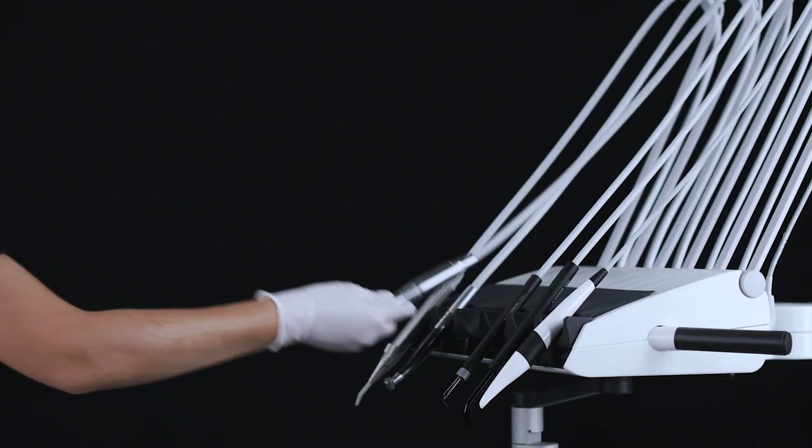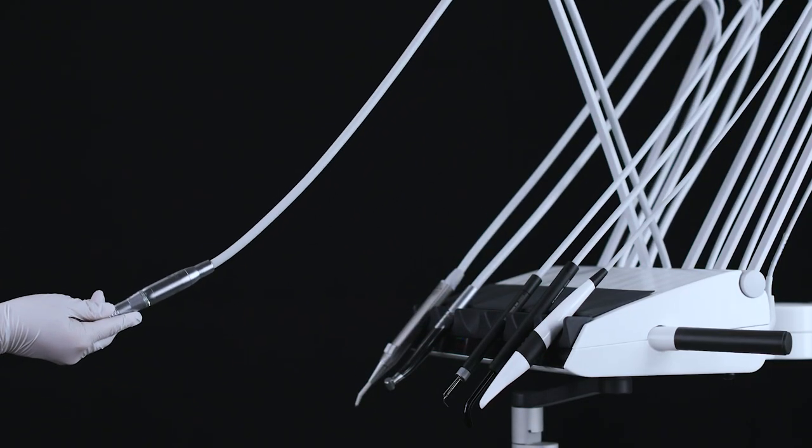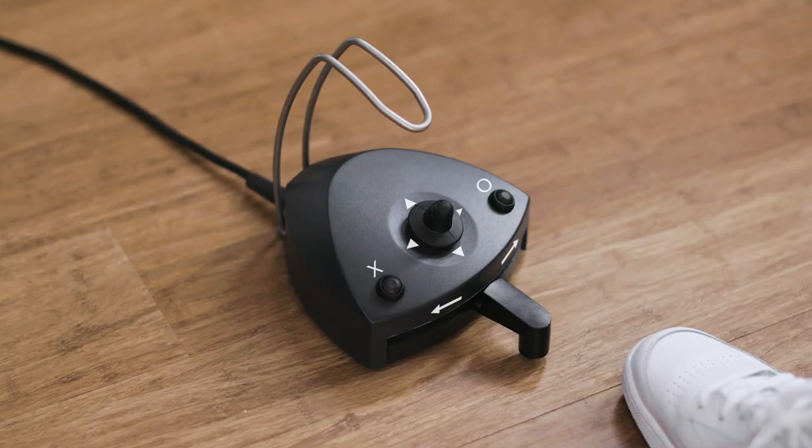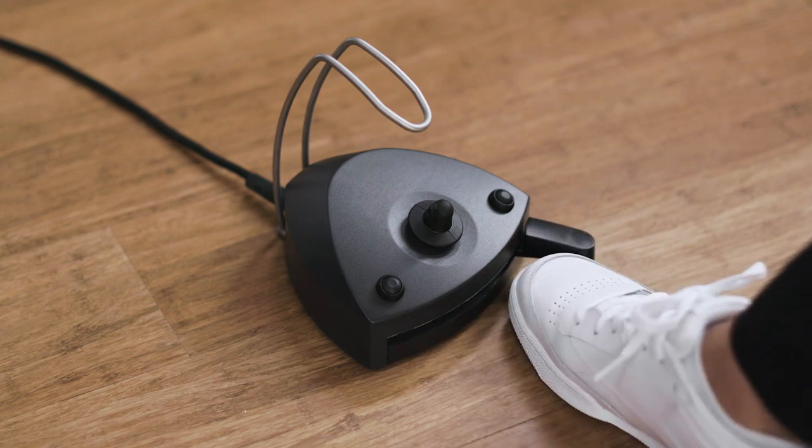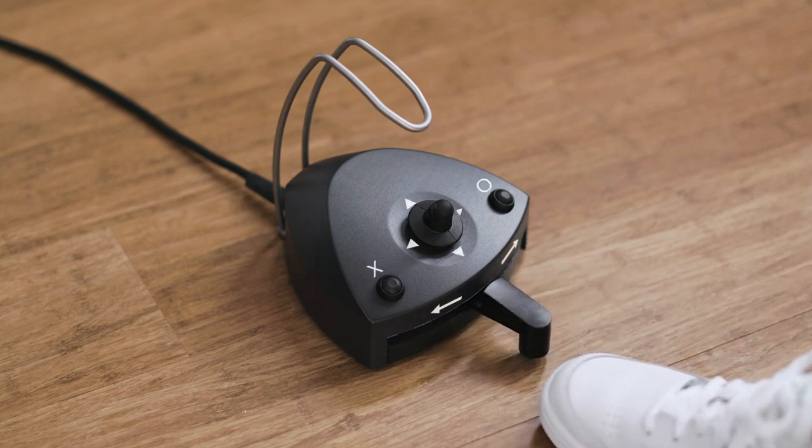Lift the micromotor forward and control it with the foot control. Activate the motor clockwise in the range of 100 rpm to the selected maximum speed. Select the maximum speed by moving the pedal right, or set it to rotate counterclockwise by moving the pedal left. You can see the maximum speed on the display when the foot control is not activated, and the actual speed on the display when the motor is running.